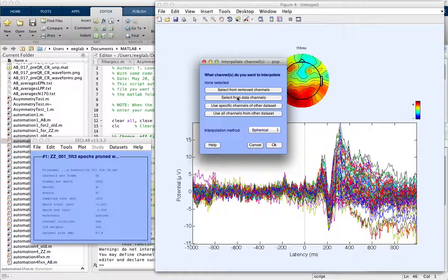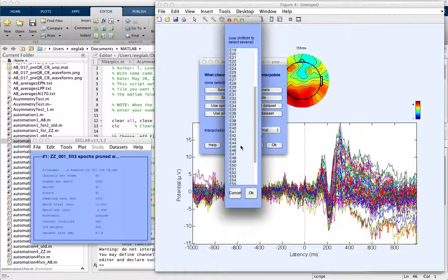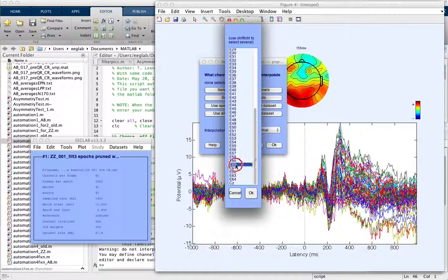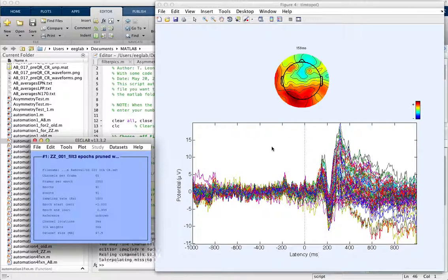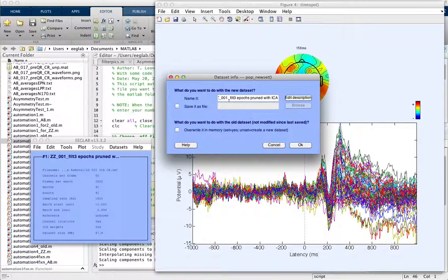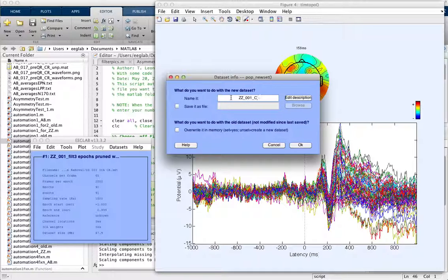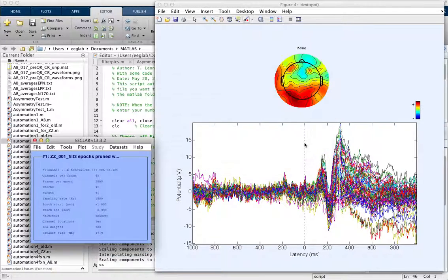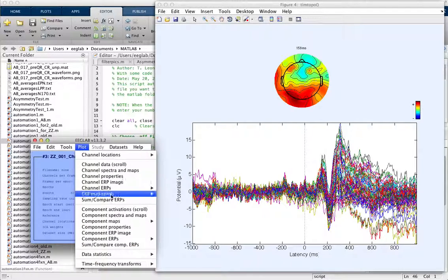Select from data channels, and then I'm going to select 11 and hold Command down and also select 60 here. Click OK and then click OK again and it's going to run. Now it's going to ask us what we want to call our new data set, so I'm going to call it 001 channels removed.